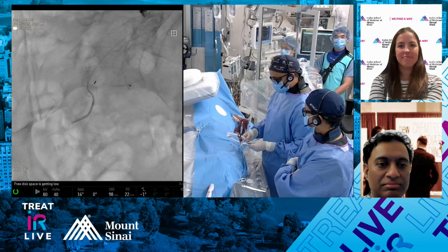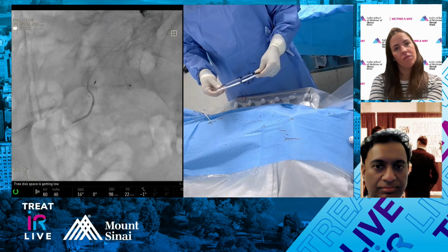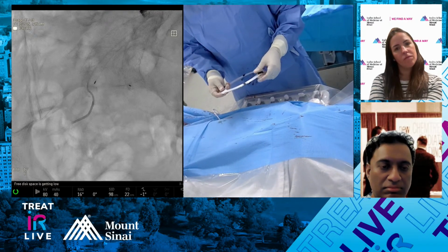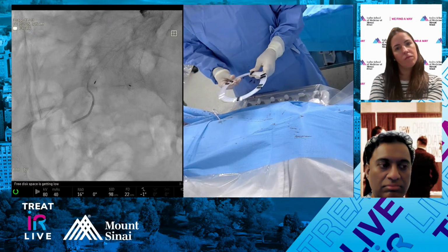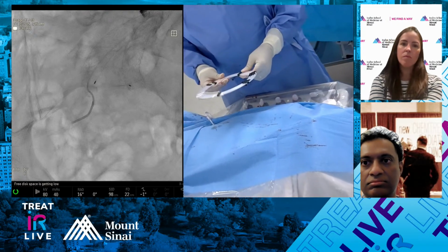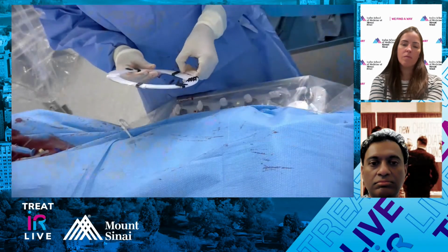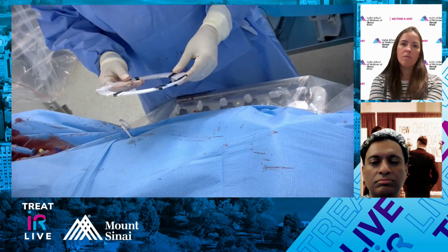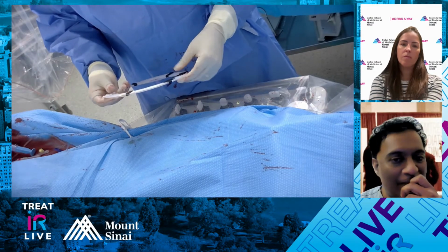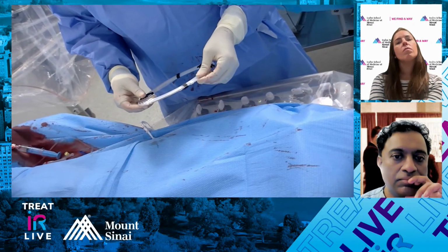Yeah, and so these are their new 035 coils. They're actually 030 outer diameter, so it's the largest volume coil on the market. There are only about 2 or 3 detachable 035 coils out there. So it's either this one, the Terumo, or technically the Retracta, the Cook coil, which is fully retractable. The 035 interlocks are great. The problem is that it's a passive detachment. They're a little bit stiff, so sometimes they can be tricky.